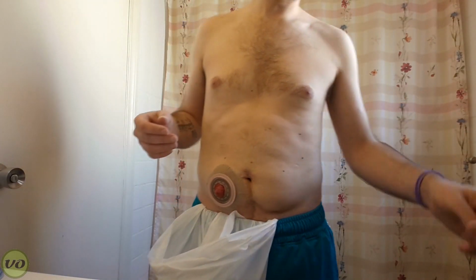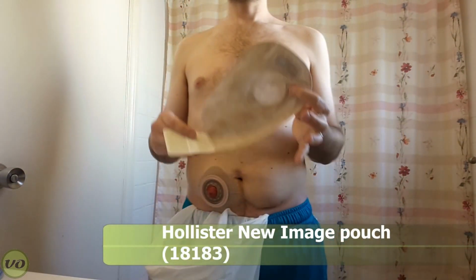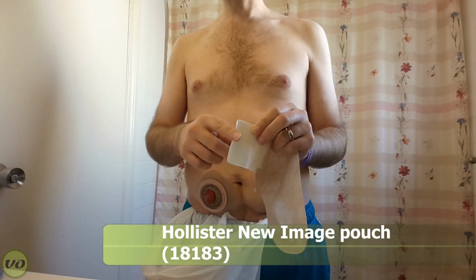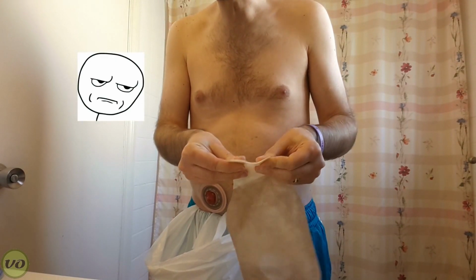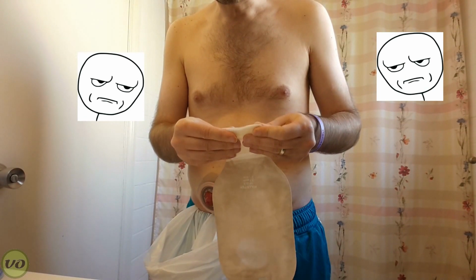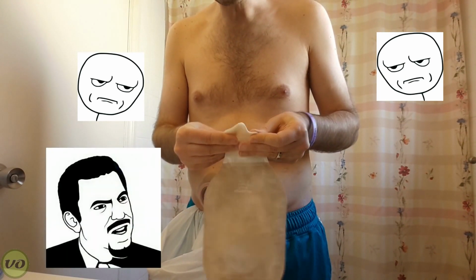All right, so that's looking good. And the last step here is to just put on my pouch. Now, for some people, the outlets on these Hollister pouches are really difficult to open. And you can see here, I'm even struggling to get that one open. So what I tend to do, when I finally do get it open here, is I crease the end of it.